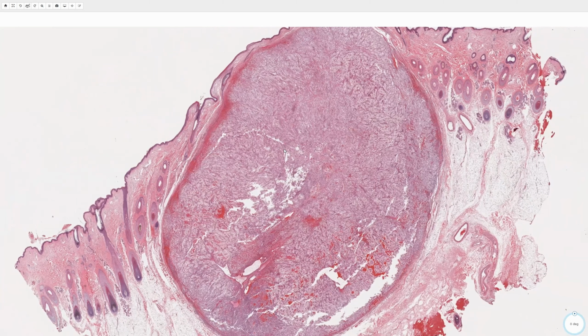Again, prominent small nucleoli, and your clear cell differential diagnosis may consist of a sebaceous tumor, which we talked about the nuclei here, an adnexal neoplasm like a clear cell hidradenoma, a clear cell squamous or basal cell carcinoma. Usually there would be some more typical areas of squamous or basaloid differentiation and maybe something involving the epidermis, a balloon cell melanoma or balloon cell nevus, a xanthoma, but not quite right for that, and maybe a benign vascular tumor. So I just want to show you one, kind of our most important differential here.